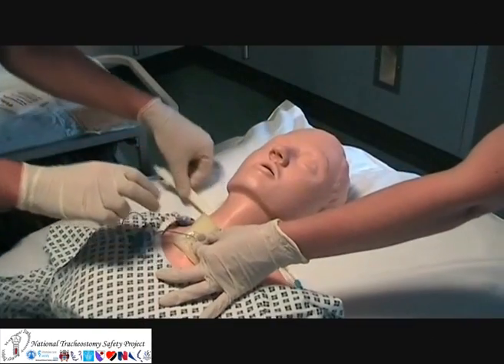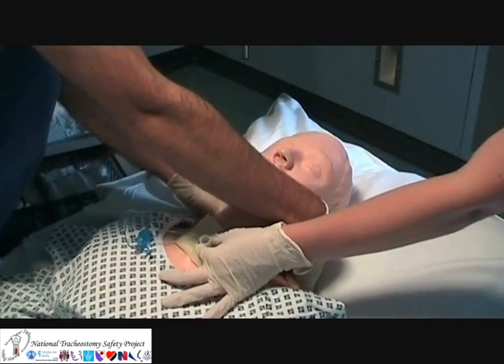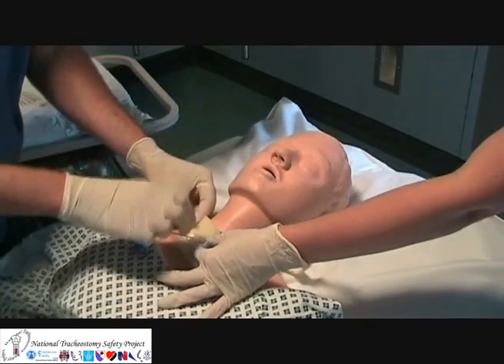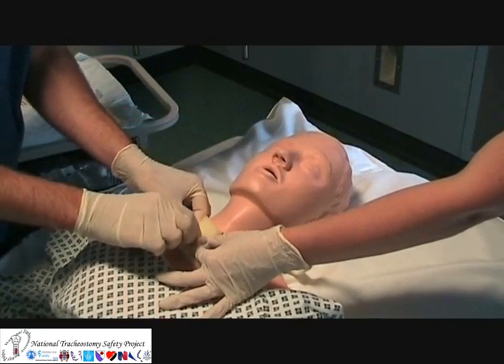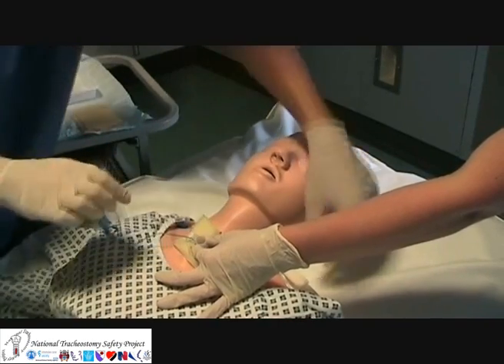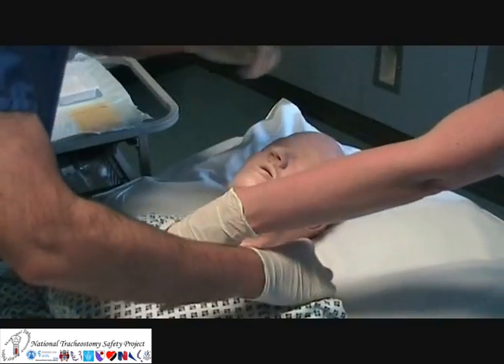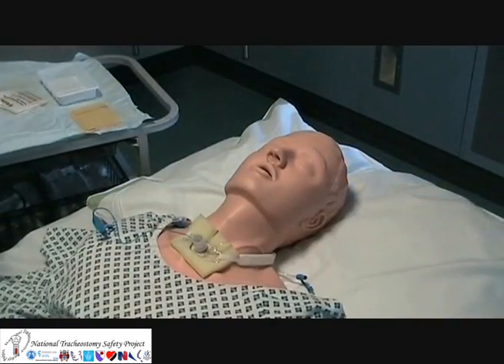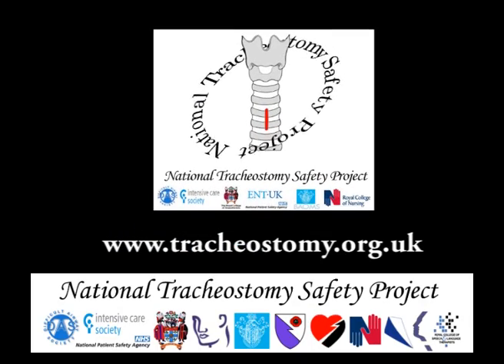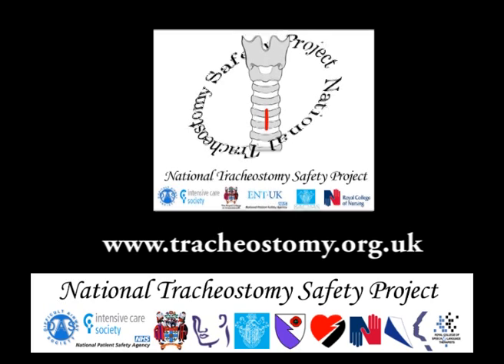The tube should be secured in place using tapes or ties. This is a good chance to change them if they have become soiled. It's also a good chance to inspect the neck — any pressure areas caused by the tube itself or by the tape should be addressed.